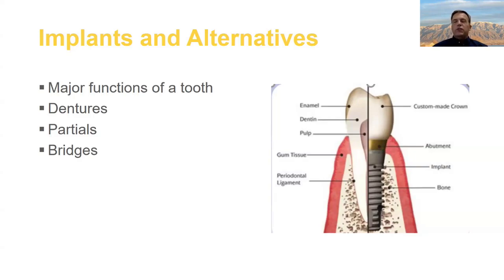And even with bridges, usually the pontics, the areas that aren't supported or aren't directly attached to the patient, are the most irritating areas to the patient because they get food impaction under there and the like. This is what I would say to a patient, is why an implant-supported restoration is the best available replacement for a missing tooth today.